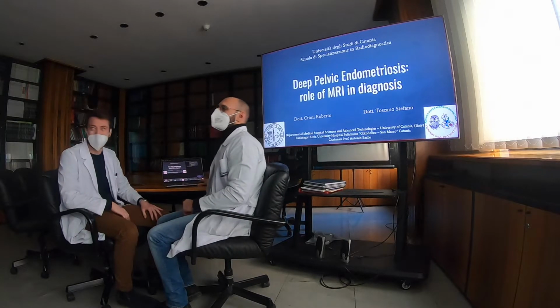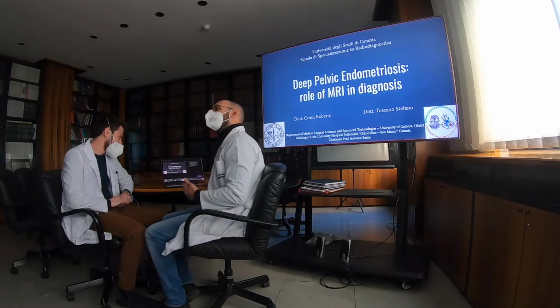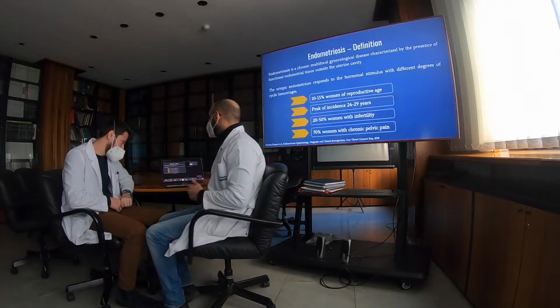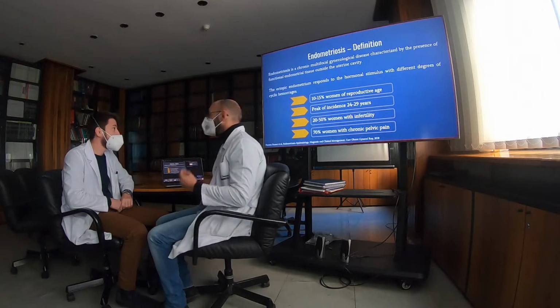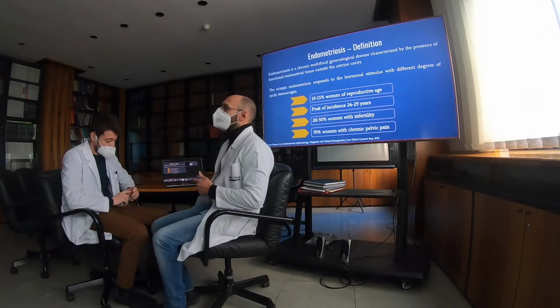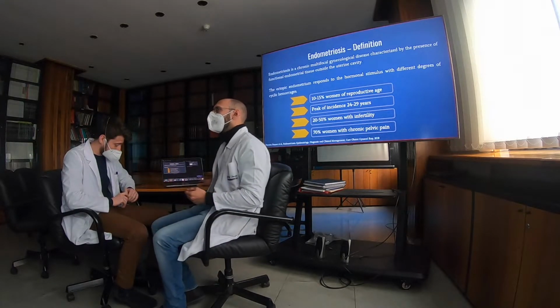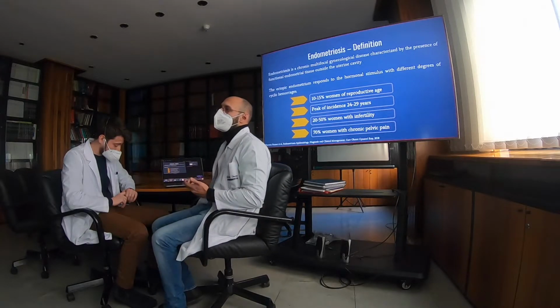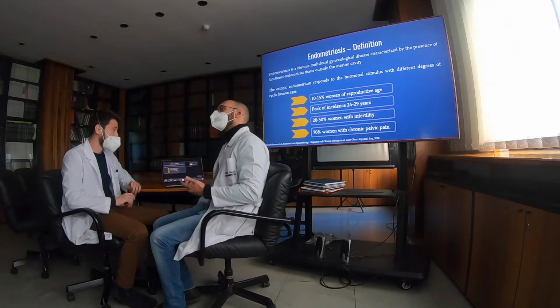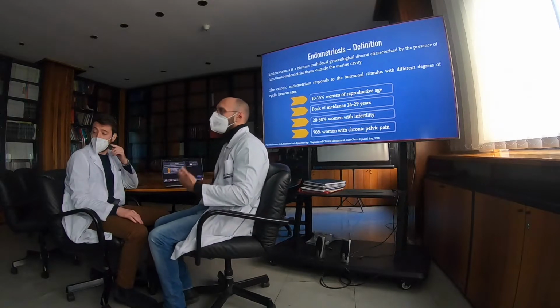Today we talk about endometriosis, deep pelvic endometriosis, and the role of magnetic resonance in its diagnosis. As you know, endometriosis is a chronic multifocal gynecological disease which is characterized by the presence of functional endometrial tissue outside of the uterine cavity. These ectopic endometriotic lesions can respond to hormonal stimulus, especially by estrogen, with cyclic hemorrhaging.